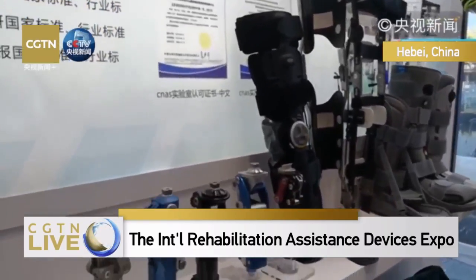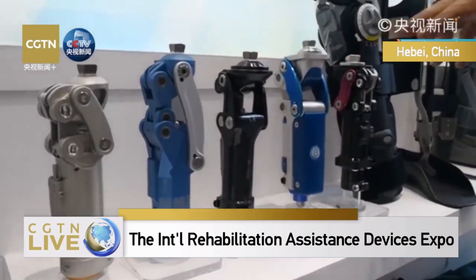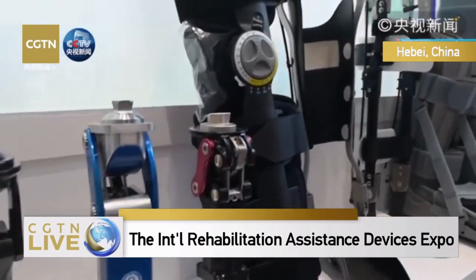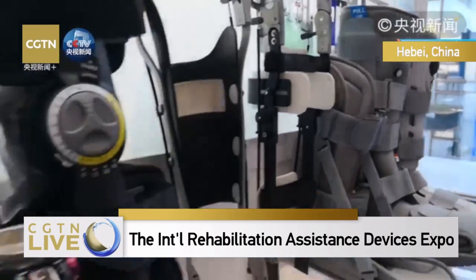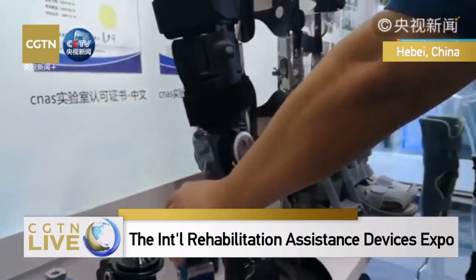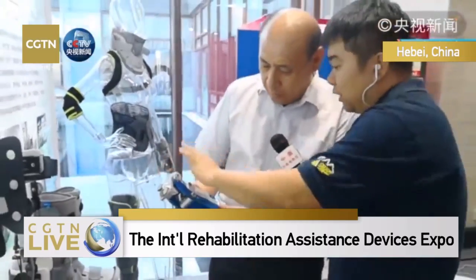If a patient is suffering from the loss of a limb, you can attach this device to the patient's limb, be it arms or legs, and it serves as a prosthetic.